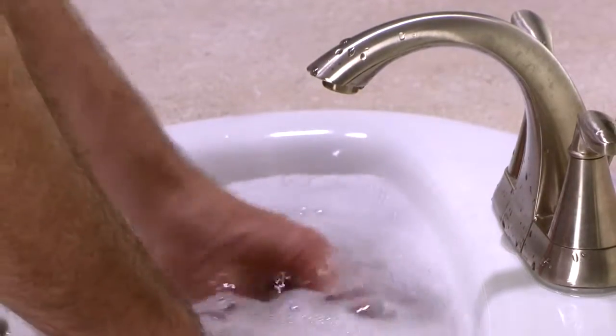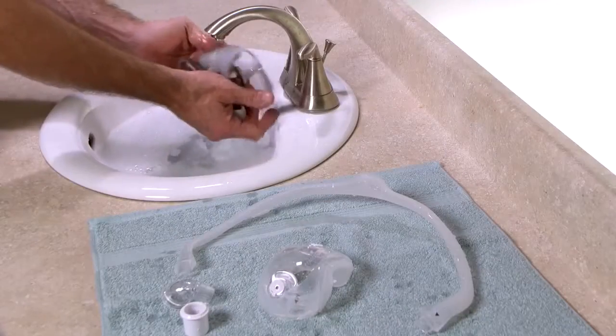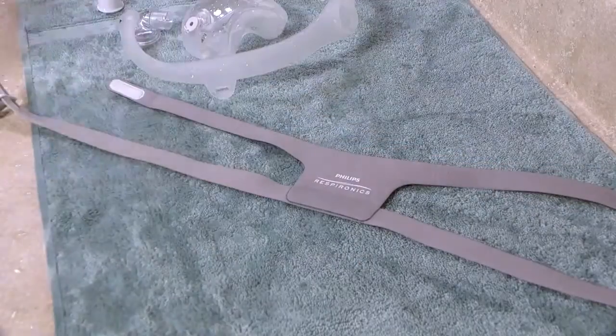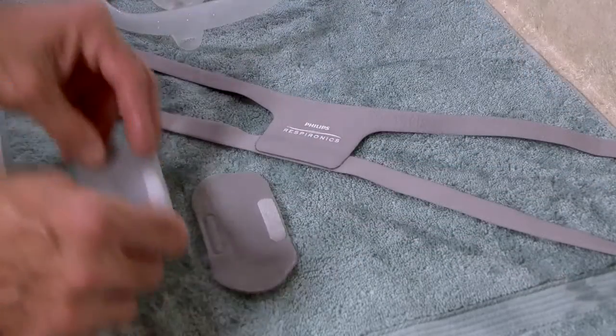Hand wash the fabric headgear and sleeves each week using mild dishwashing detergent. Spread the clean, wet fabric parts out flat or hang them on a line to dry. Do not place them into the clothes dryer.